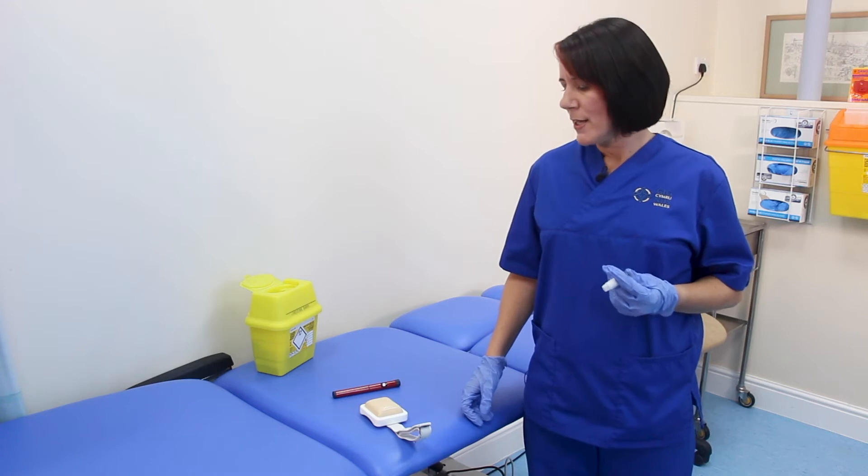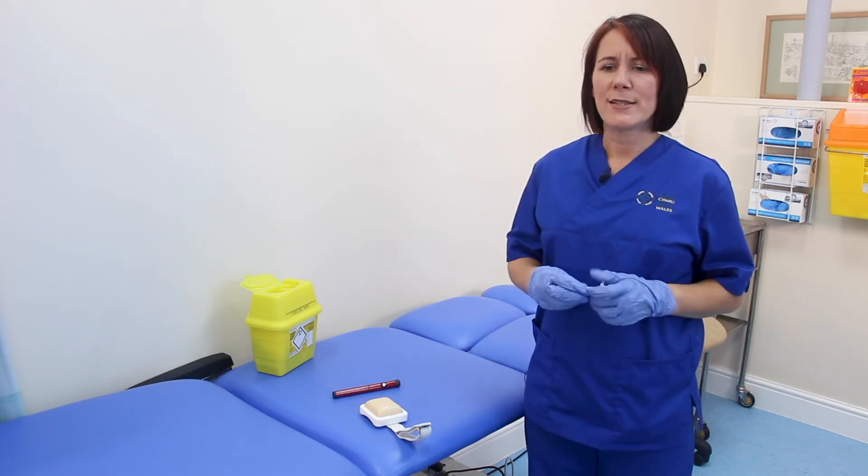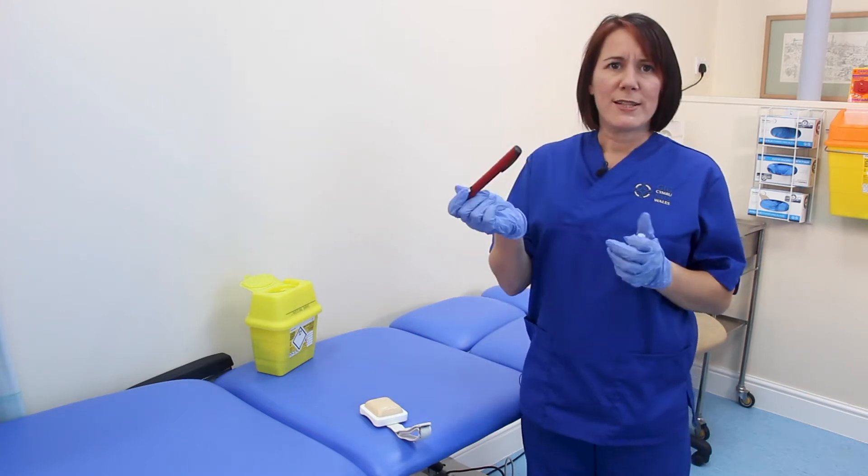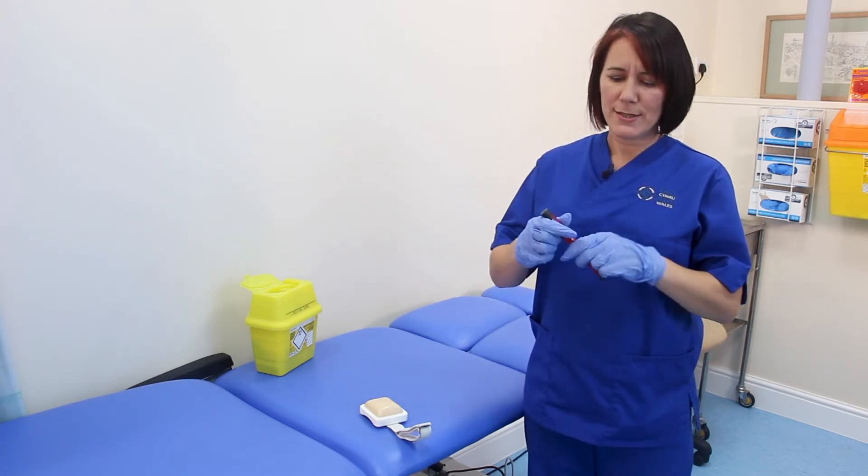If you're going to be injecting your child in school, you need to be using safety needles. First, choose your child's injection site — you should have agreed injection sites with your child's family or your diabetes team. Your child will have an insulin pen that looks similar to this.